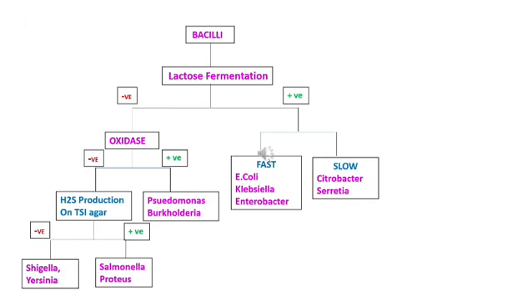Please go through the flowchart thoroughly and remember all the key points. These points will definitely help you crack most bacterial identification questions.